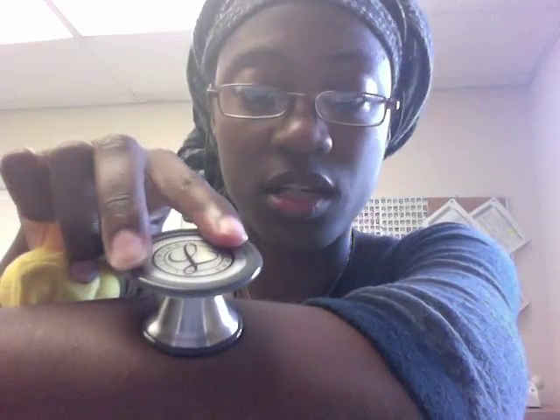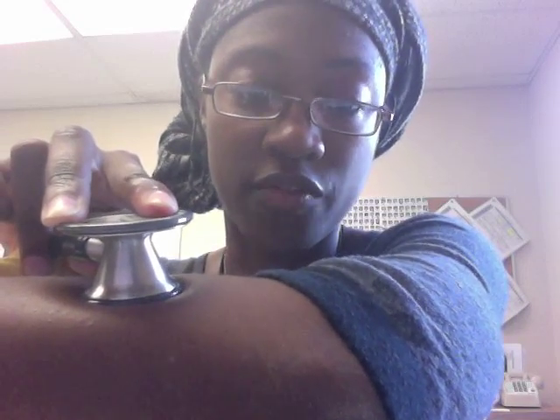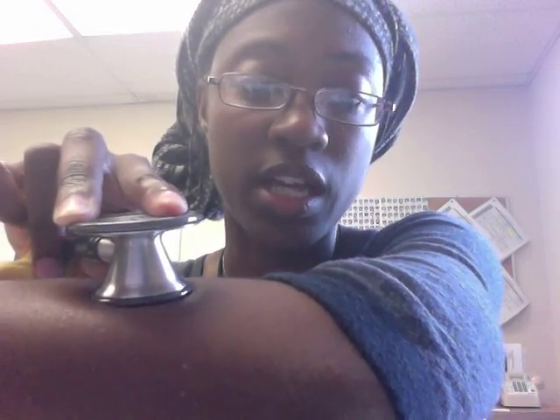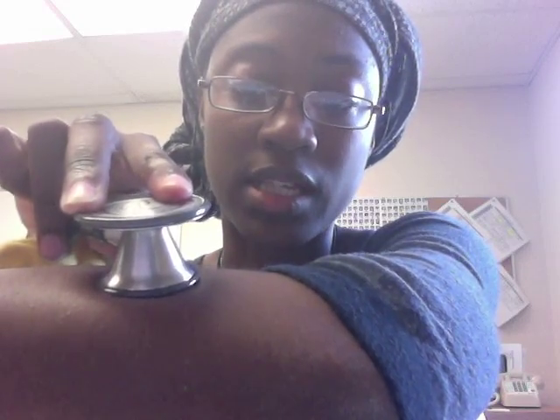I'll show you how to use it on the pediatric, smaller side of my stethoscope. In order to engage the diaphragm, all I have to do is press very firmly down — you'll notice a little bit of indentation, which means I'm engaging the diaphragm and listening for high-pitched sounds. In order to engage the bell, I gently place it on the skin so it's not pushing down hard enough to make a dent, but it's creating a seal with the gray portion on my skin. So: firmly down for diaphragm, lightly with a seal for bell.